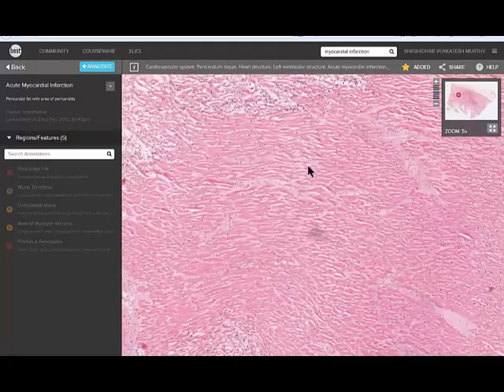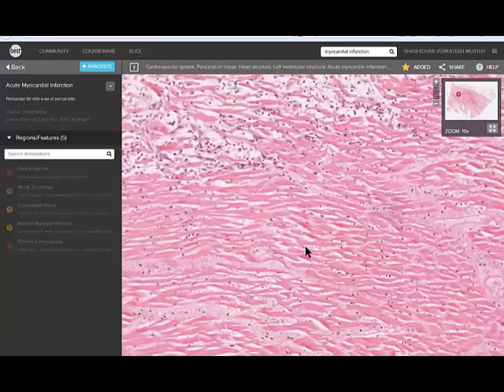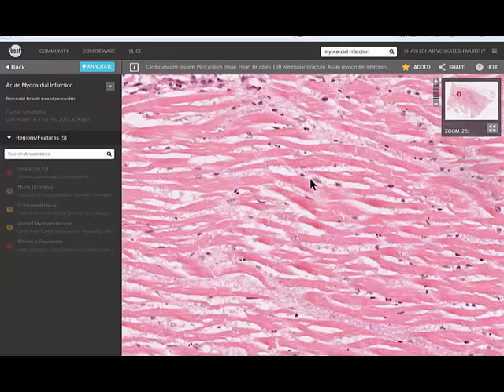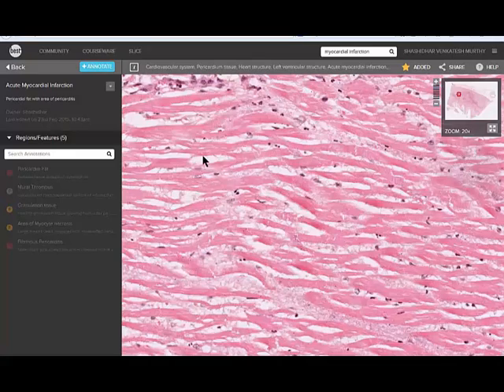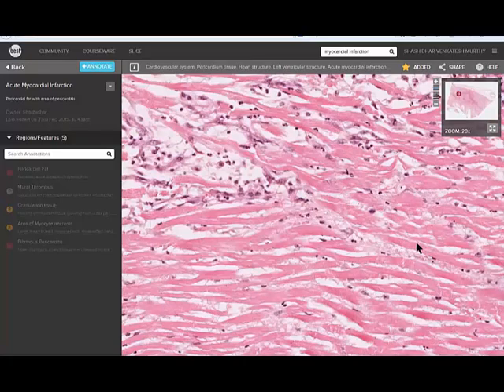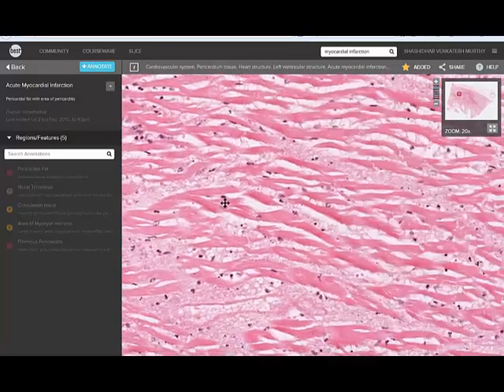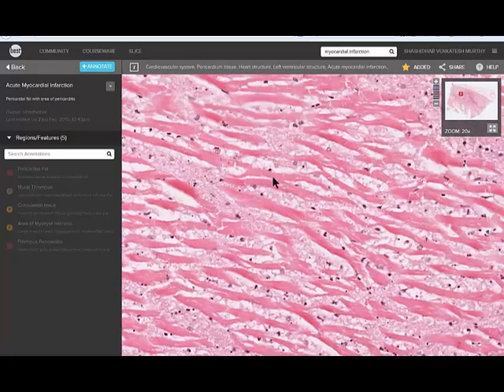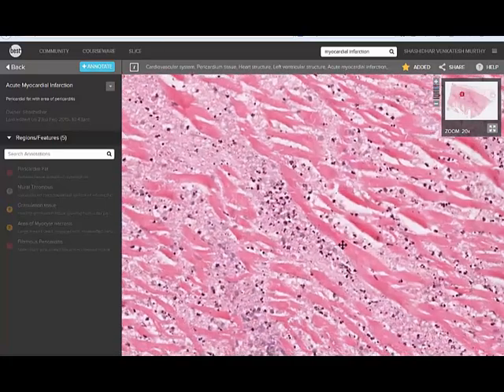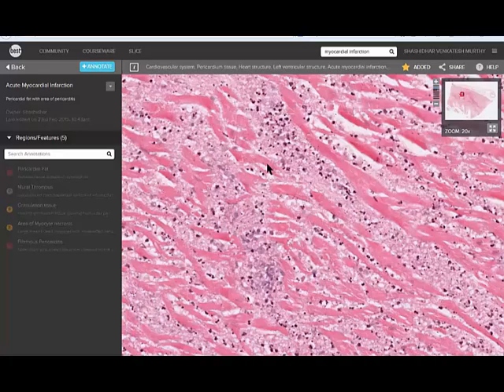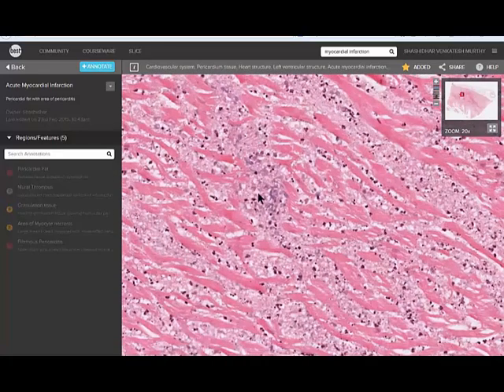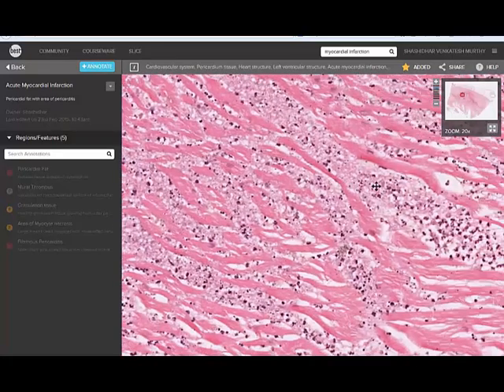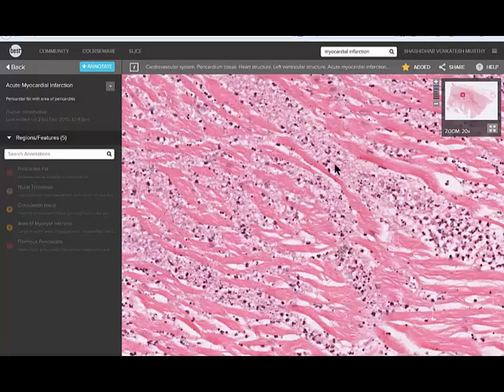If you see, this area is more red than this area and if you observe closely, these myocardial fibers have lost their nucleus in the center. Only you are seeing nucleus of inflammatory cells in between and there is more space in between. This is the edema, inflammatory cells. This is dead myocardial fibers, and as we move towards the surface, there is more and more edema, dead tissue, the inflammatory cells and more inflammatory cells where the muscle is disappearing. This is the actual digestion happening of the dead tissues by the WBCs.